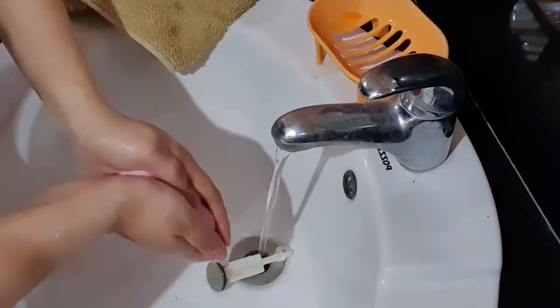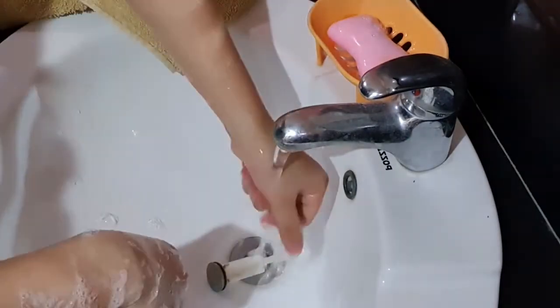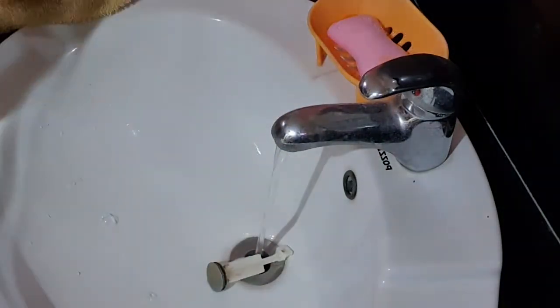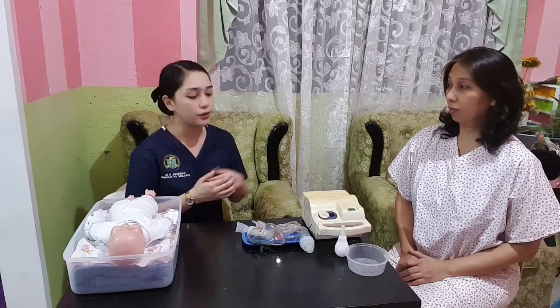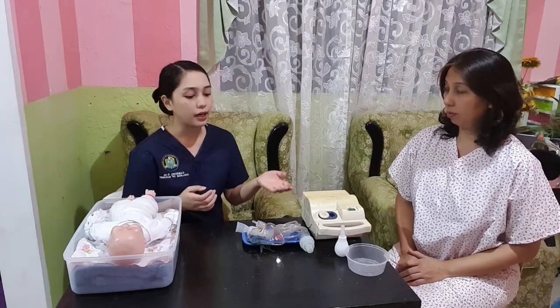Now for the performance phase, first is to perform hand hygiene and to arrange the equipment that I will be needing. So hand hygiene reduces the transfer of microorganisms and arranging the materials saves time. So here I have already gathered and prepared and arranged my materials that I will be using, on which I can conveniently use them when needed.